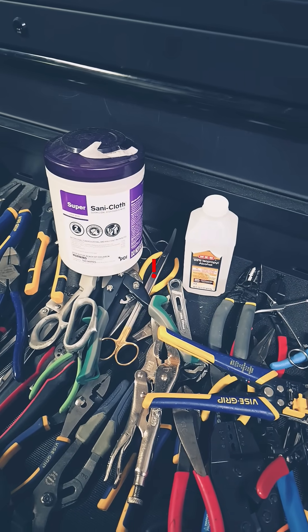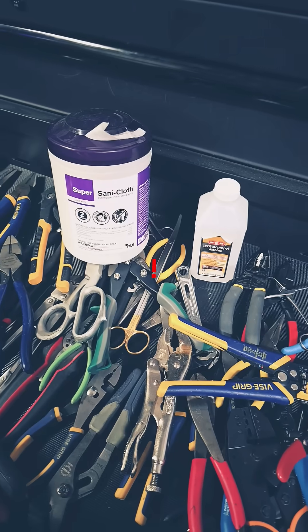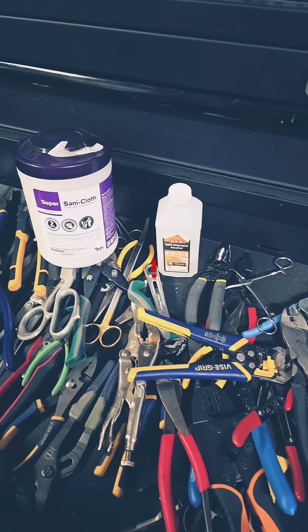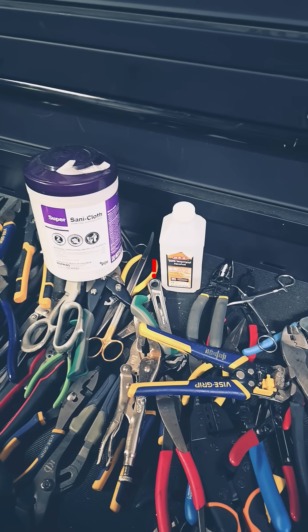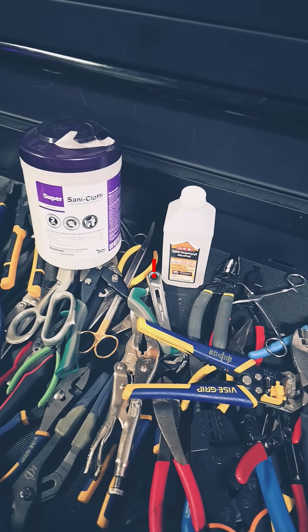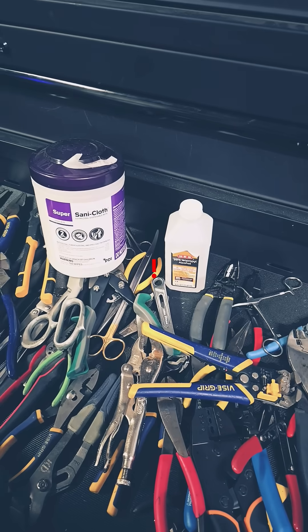However, just be wary that if you're using bleach wipes, which are very common throughout medical facilities, bleach wipes can and will pit stainless steel. Stainless steel has an oxidized layer, and once you break through that oxidized layer it will cause further corrosion in the future. So we stay away from bleach wipes.